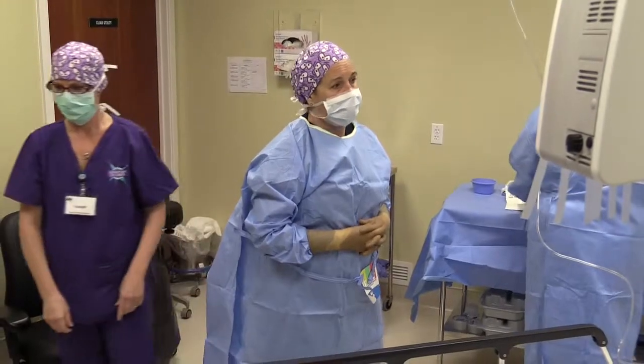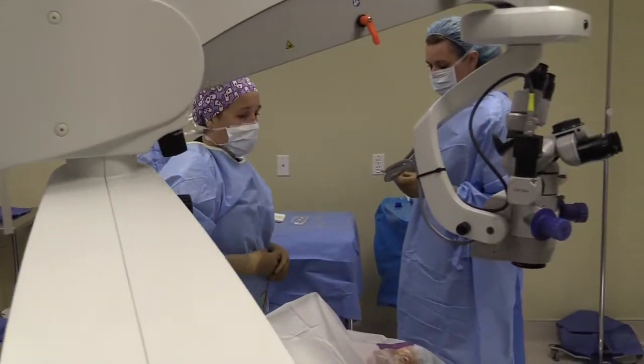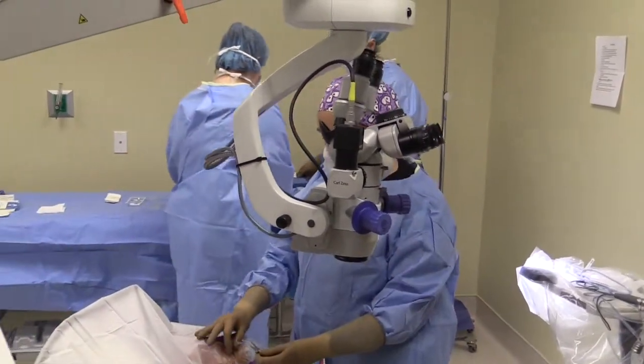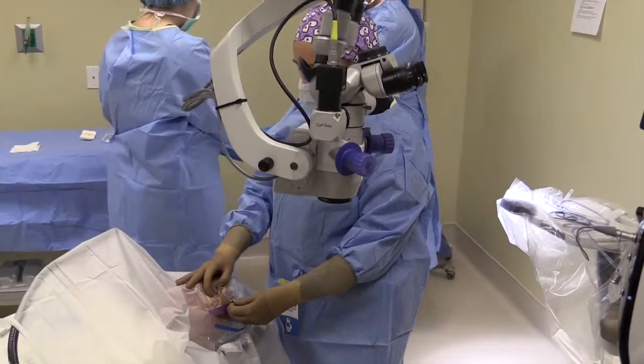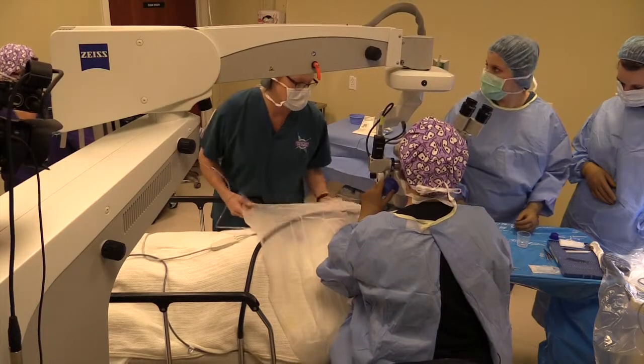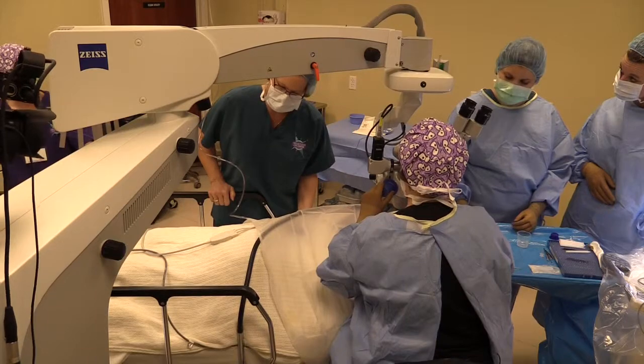This is just a different animal in terms of the way it handles and acts, and the way it helps us control this surgery. So again, we're going to hold her eyelid open with a lid speculum, and Ms. Brown is on the home stretch now. If I could please have the bed up just a little bit. Nice deep breath in and out. Thank you. All right, that's good.